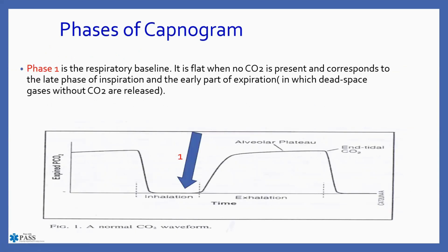All right, so phase 1, this is called the respiratory baseline. If you think about it from an EKG perspective, a lot of this makes sense. Looking from left to right in an EKG, we're looking at time. And as we look from left to right on your capnography waveform, we're also talking about time. So if we take more time to exhale, for instance, if we're looking down here, you can see exhalation is a pretty decent amount of time.